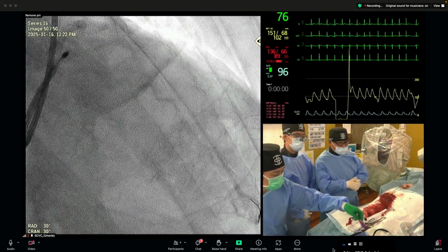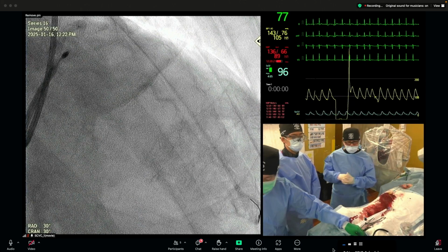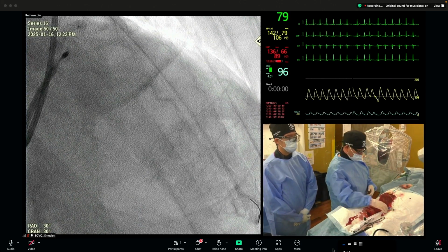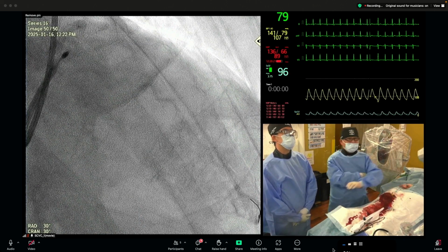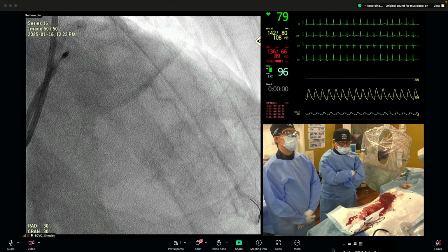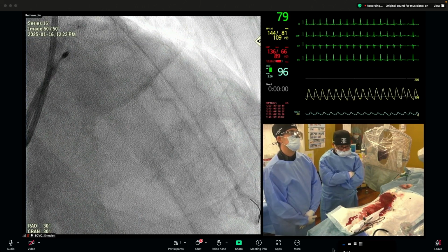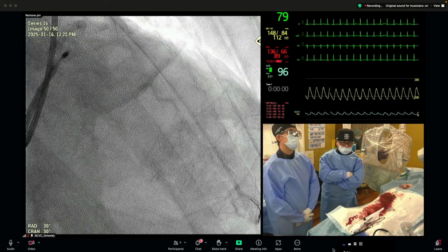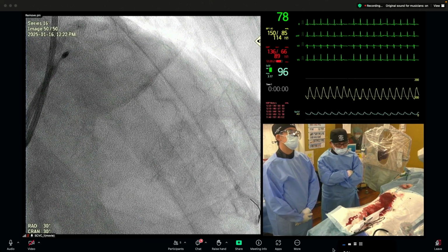Adrian, please discuss something. So I think the IVUS shows the calcification very nicely. It doesn't appear to be concentric. Do you think that you could get away with just a simple cutting balloon strategy?